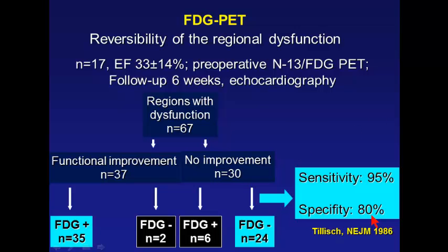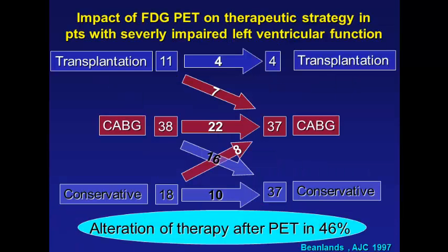That's important because people will ask you, well, how sensitive and how specific is it? Well, this was the first pilot single-center, not randomized study, certainly overestimating the quality of this test, but it was paving the way for its use. This was one of the first trials here, and you see the years, 86, 97, so it took quite some years to build up the database, and this still is not an impressive number of patients, but was an excellent study from Rob Beanlands from the Ottawa Heart Center.